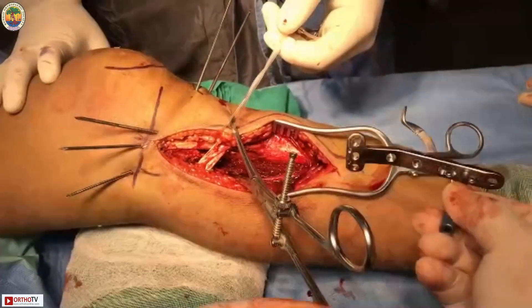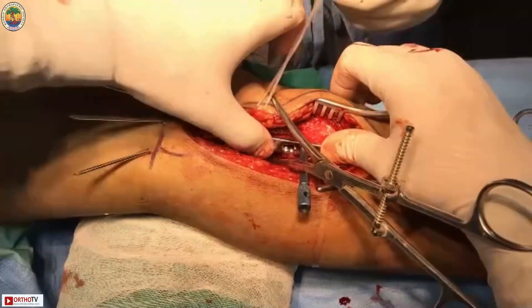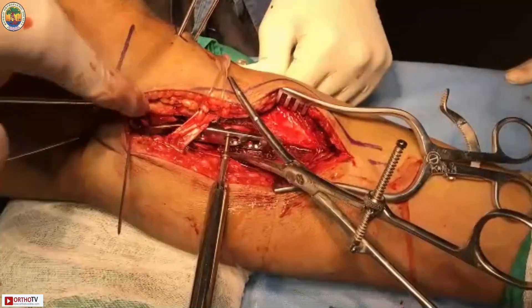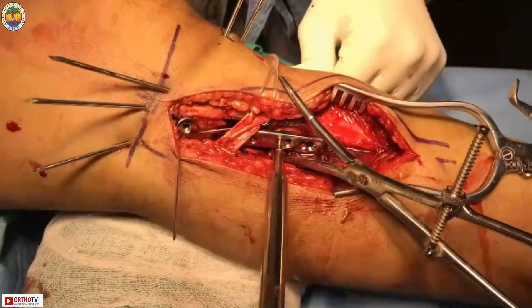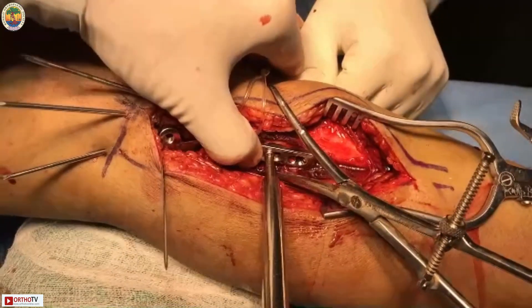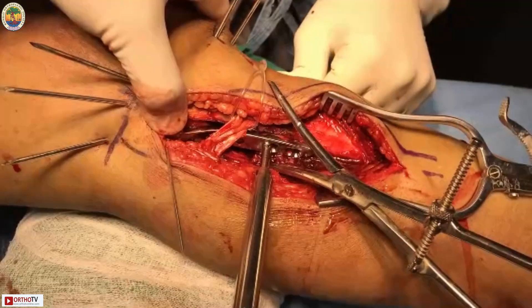The posteromedial plate is passed from distal to proximal, which is easier. The position of the plate is confirmed under image intensifier to ensure the height is correct. A plain cortical screw is placed first to get the plate flush to the bone on the posterior side, acting in buttress mode, with the screw at the apex of the fracture site. The fracture is now completely compressed.